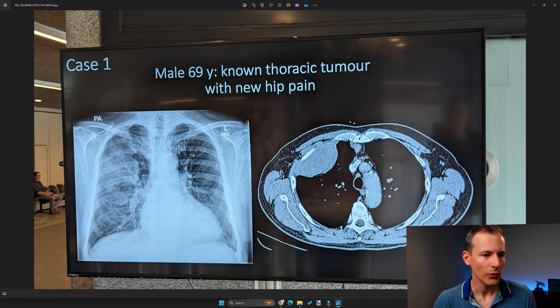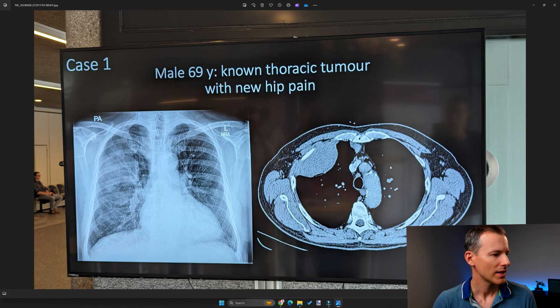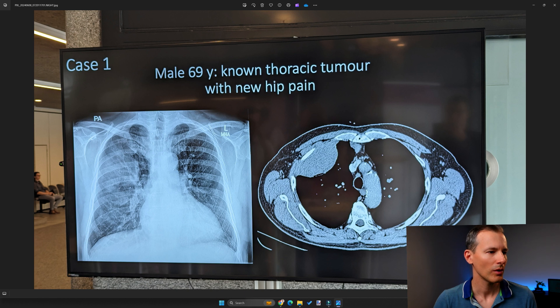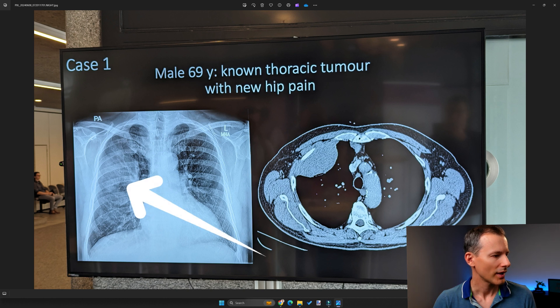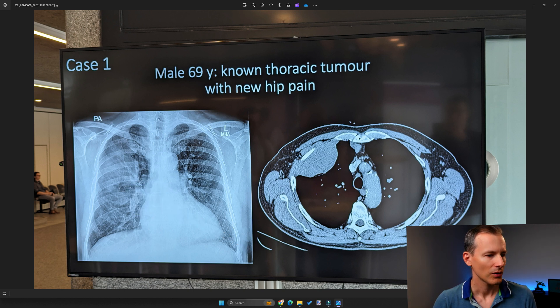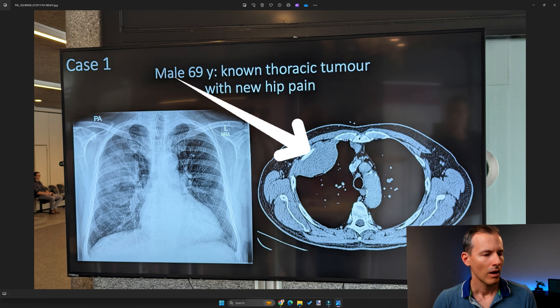This is case one — it was shown on one of the big screens. Case one was a male, 69 years old — an older patient — with a known thoracic tumor and new hip pain. We can see the radiograph here with the opacity on the right lung, and on the chest CT we also have this mass visible.